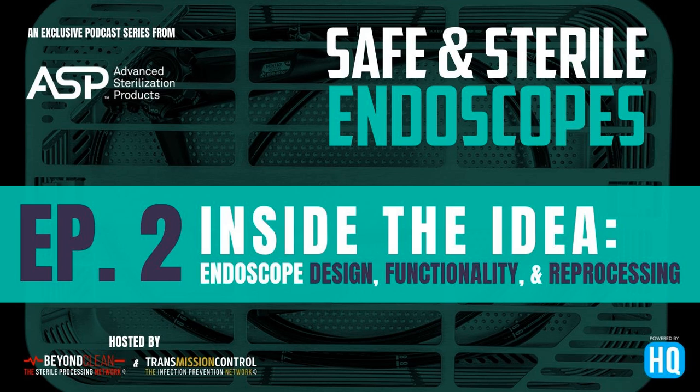No, I think when we look at the lumen size and length claims that we've had in the low temp sterilization market for our gas plasma technology for STERRAD over the years, the smaller diameter scopes, the bronchoscopes, cystoscopes, laryngoscopes, ENT scopes, things like that, those lumen lengths fell into that category that was already capable of processing lumens in single lumen scopes. We just had to work with those MDMs to make sure that they were functional after the cycles. So years ago, we had this little half moon symbol that was added to some of the devices so that the technicians would know, hey, this scope can be sterilized in the STERRAD versus just high level disinfection.